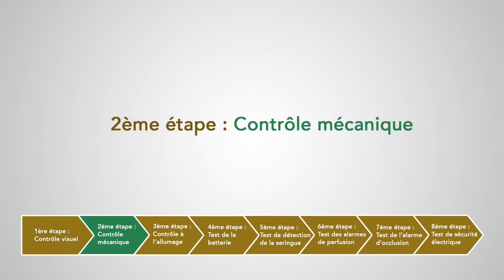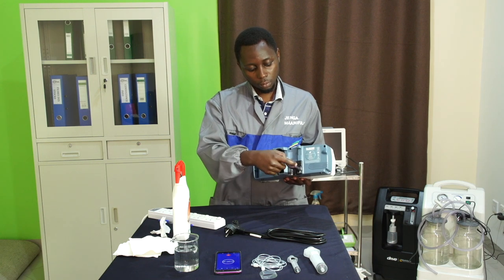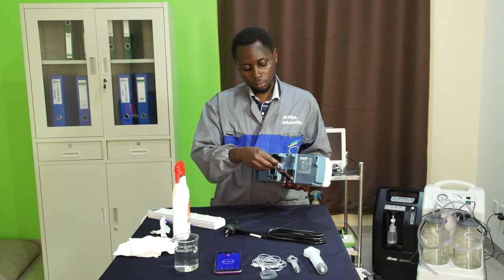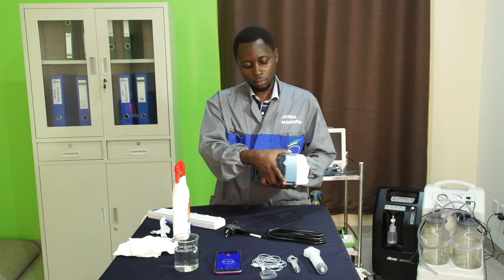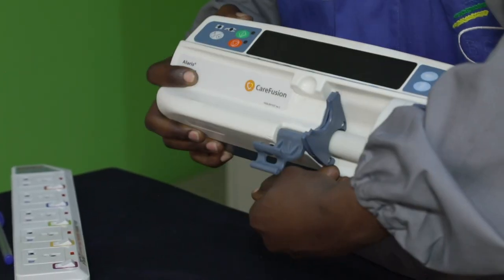Deuxième étape : contrôle mécanique. On va vérifier que la fixation du pousse-seringue est en bon état. On va ensuite vérifier l'état du porte-seringue et de la tête d'accroche du piston de la seringue, et que son déplacement le long de l'axe est fluide.